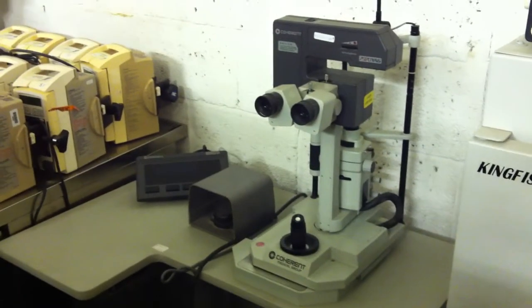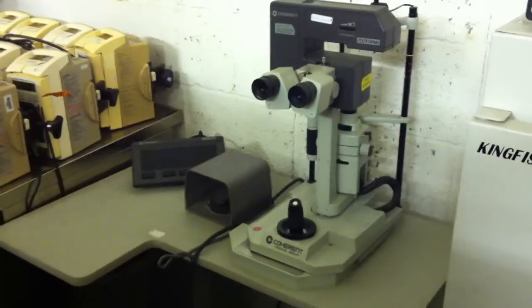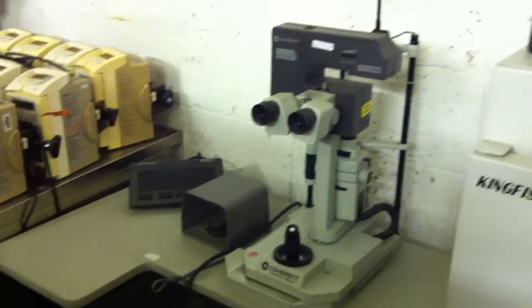This is a YAG 7970 coherent laser for the correction of the eyes. It's complete. This is the base unit for it.